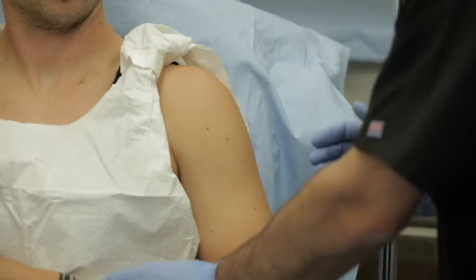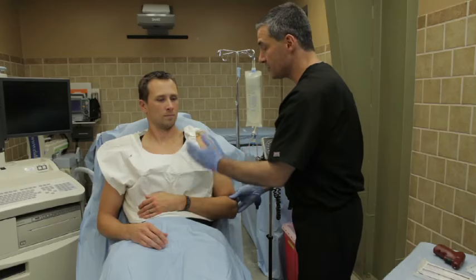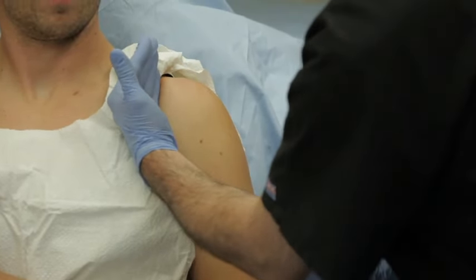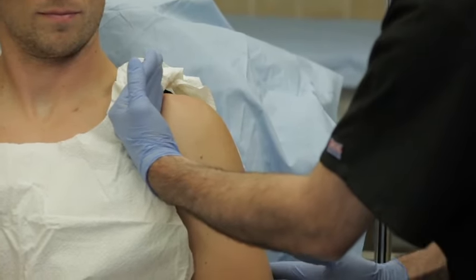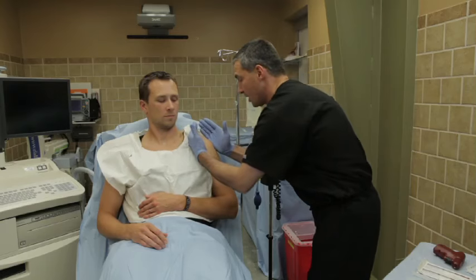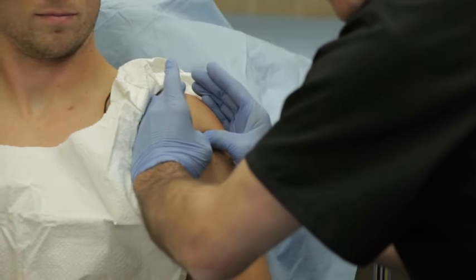With the patient's hand over the abdomen, elbow tucked in, and the arm adducted against the body, one should place the ulnar aspect of the left hand in the axilla to help define the anterior border and keep out of the medial aspect of the arm, which is where the brachial plexus resides. The other hand should be placed in a perpendicular fashion in the midline of the upper arm, and where the thumbs come together will define a line over which you should be palpating to feel for the surgical neck.